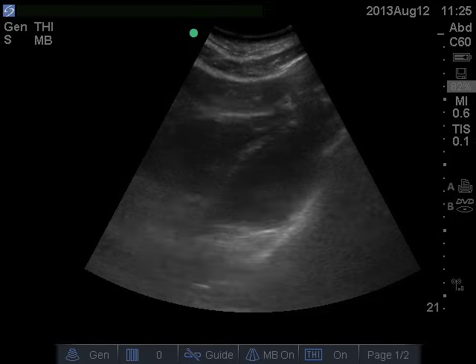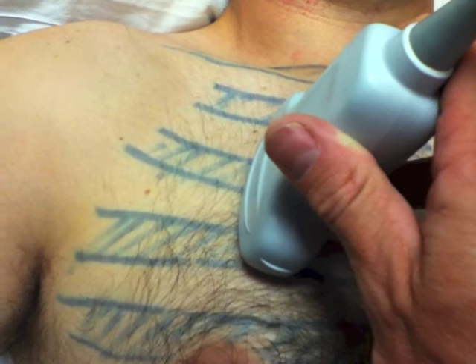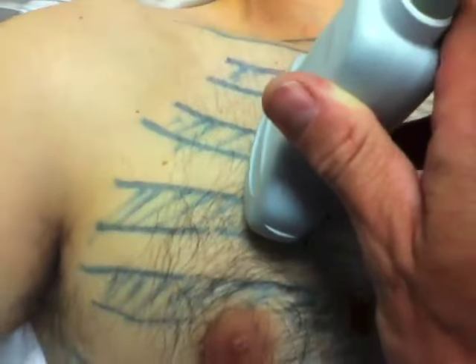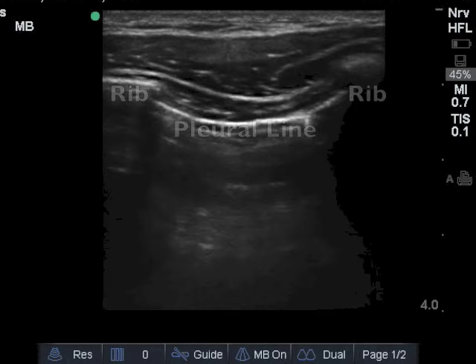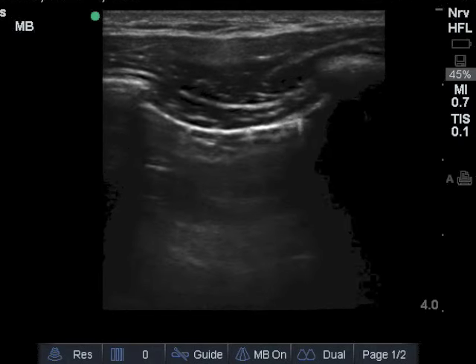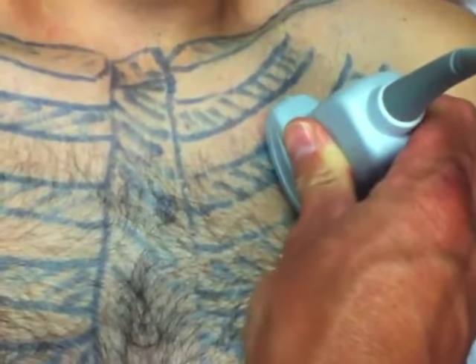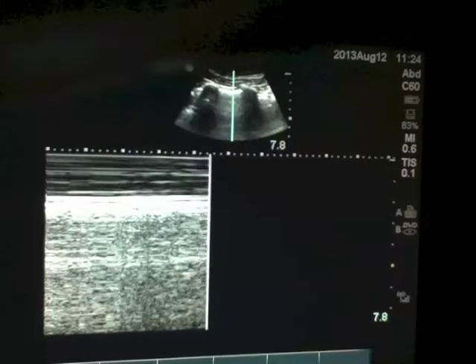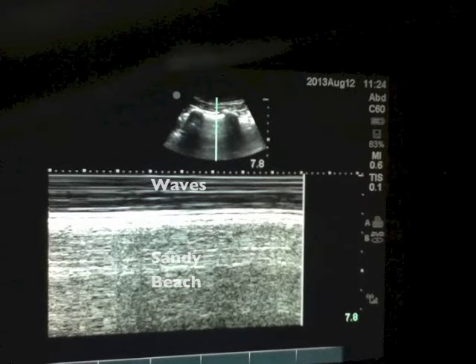You shouldn't see any black fluid stripe around the heart. Look for good squeeze or function. Finally, to look for pneumothorax, place the probe on the patient's chest perpendicular to the ribs. Decrease the depth to 10 centimeters and move the probe up or down to look for good lung sliding. Exact same thing on the other side. If you know how to do M-Mode, place the cursor across the pleural line between the ribs, watching for the waves on a grainy sandy beach — indicating no pneumothorax.